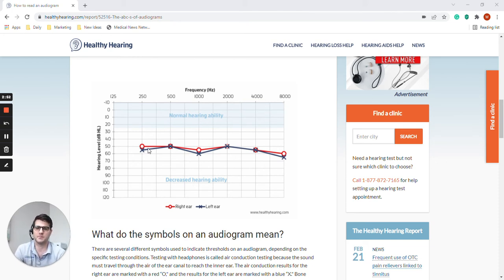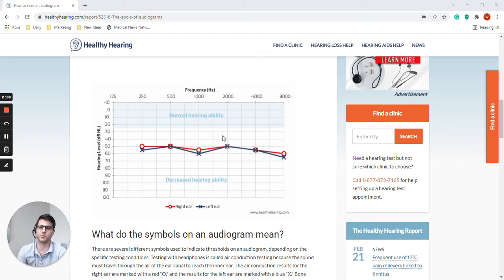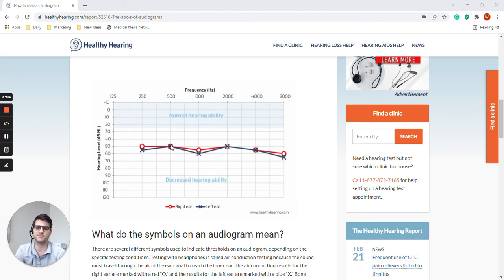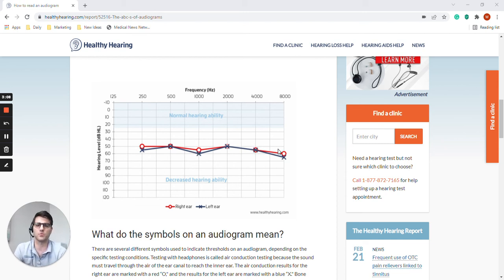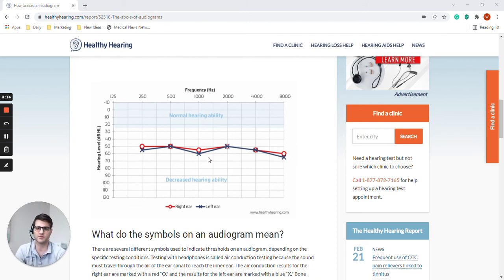These results are indicative of a hearing loss. We know enough with this that we can diagnose a hearing loss. We don't necessarily know what type of hearing loss it is, because just air conduction scores on their own are not enough to diagnose if it's a conductive hearing loss, a mixed hearing loss, or a sensorineural hearing loss.